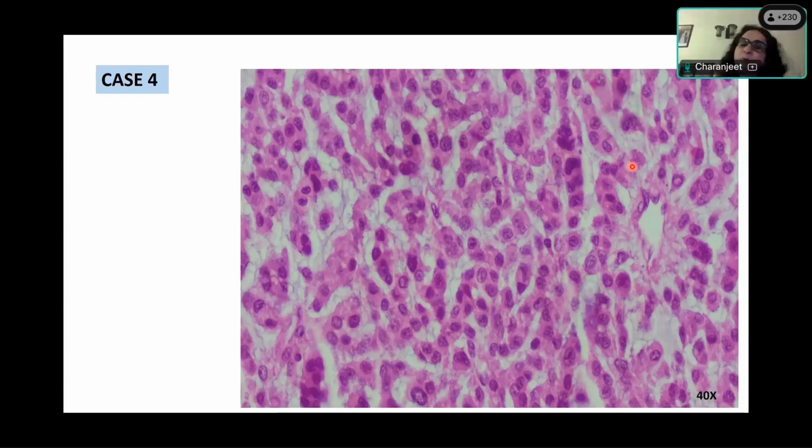Okay. So what do you call the cells of a chordoma? What is the description of those cells? Chordoma cells? Physaliphorous cells. Physaliphorous cells. So they are large cells with abundant vacuolated cytoplasm. They are called physaliphorous cells. Yes, very good. People are writing in the chat box. Absolutely correct. Physaliphorous. Okay. Third differential.